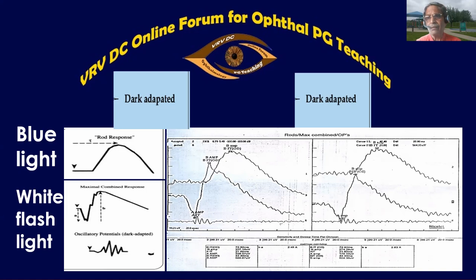That is called ERP. What is ERP? Early receptor potential. What do you mean by that? Exam question again: what do you mean by early receptor potential? What's the significance? Your answer is, sir, when light is falling on the retina in a dark adapted eye, we have the rhodopsin cycle going on. You know that. Now what's happening? The rhodopsin cycle has so many steps.